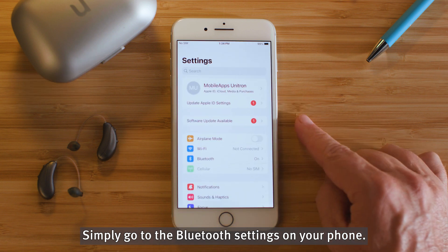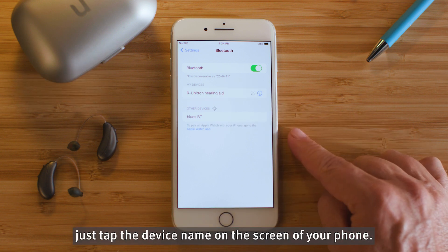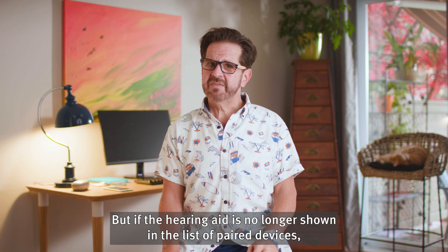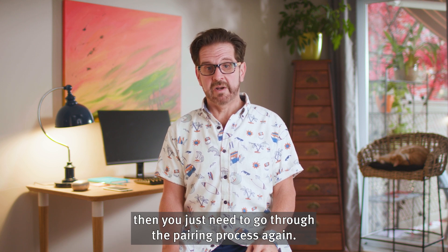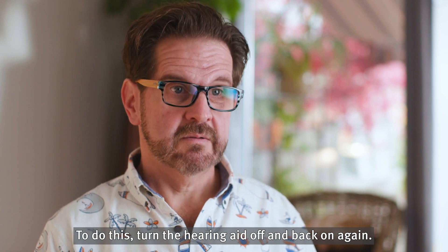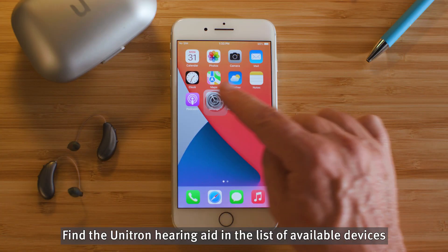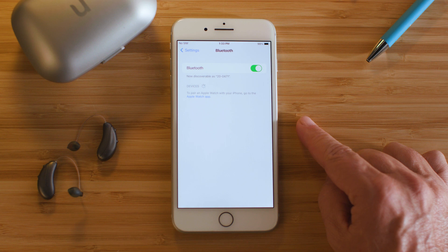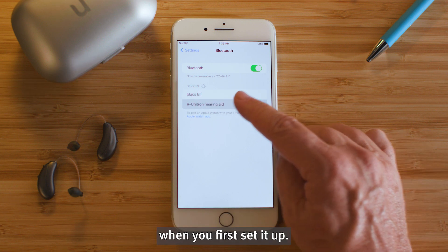Simply go to the Bluetooth settings on your phone. If you see that the Unitron hearing aid is still visible as a paired device but not connected, just tap the device name on the screen of your phone. But if the hearing aid is no longer shown in the list of paired devices, then you just need to go through the pairing process again. To do this, turn the hearing aid off and back on again. It will enter pairing mode and stay there for three minutes. Find the Unitron hearing aid in the list of available devices and just tap to select it, just as you or your hearing care professional did when you first set it up.